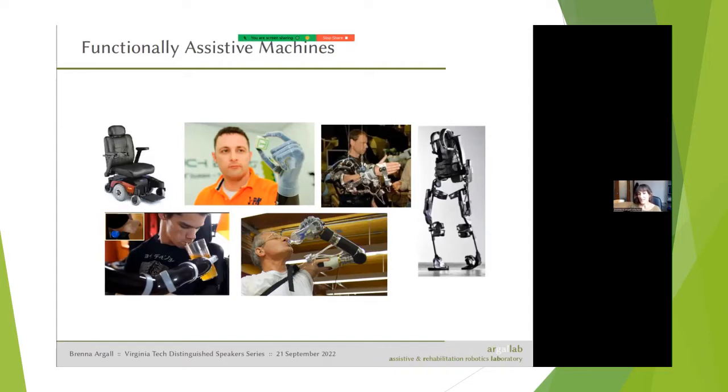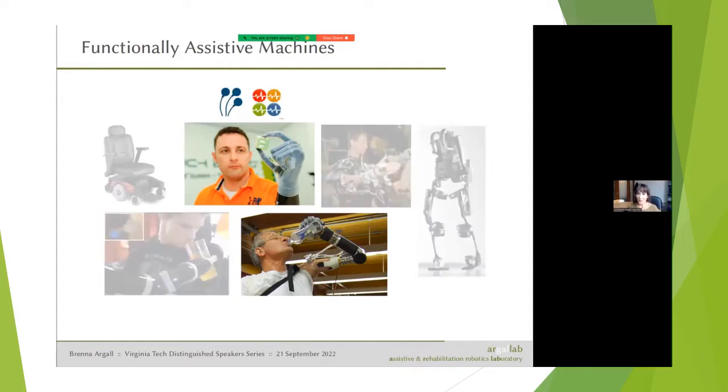Now, across the field, the common challenge with these machines is in capturing control signals from the human body in order to operate them. Perhaps the most poignant example is upper limb prostheses, where typically they are EMG controlled. An array of electrodes are put on the muscle. Ideally, you want to use muscle on the residual limb because then you can use the same neural pathways in order to control the robotic limb that you would use to control your intact human limb. But this conundrum exists where the higher the level of amputation, the fewer residual muscles remain to capture these control signals from. And so the dimensionality of your control interface is going to be lower than the dimensionality of the device that you are trying to control.